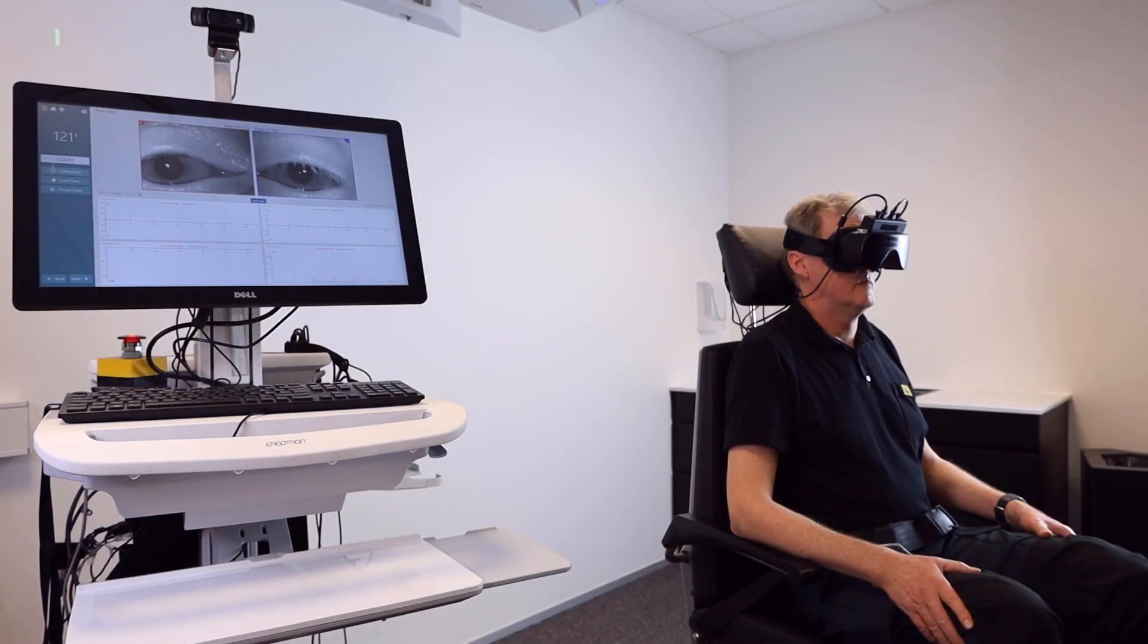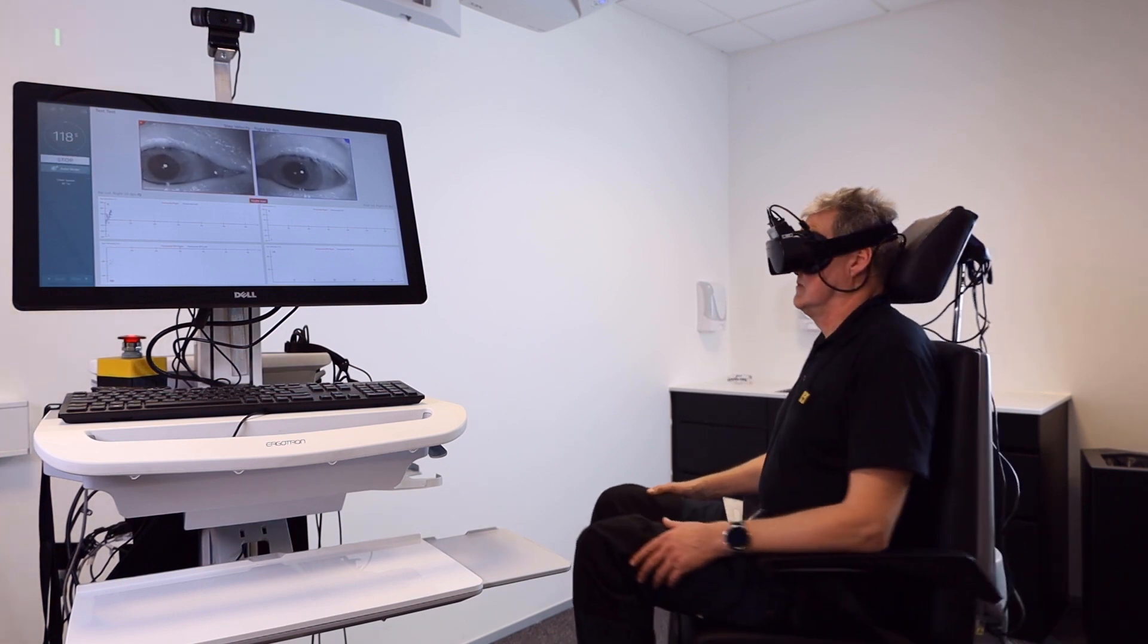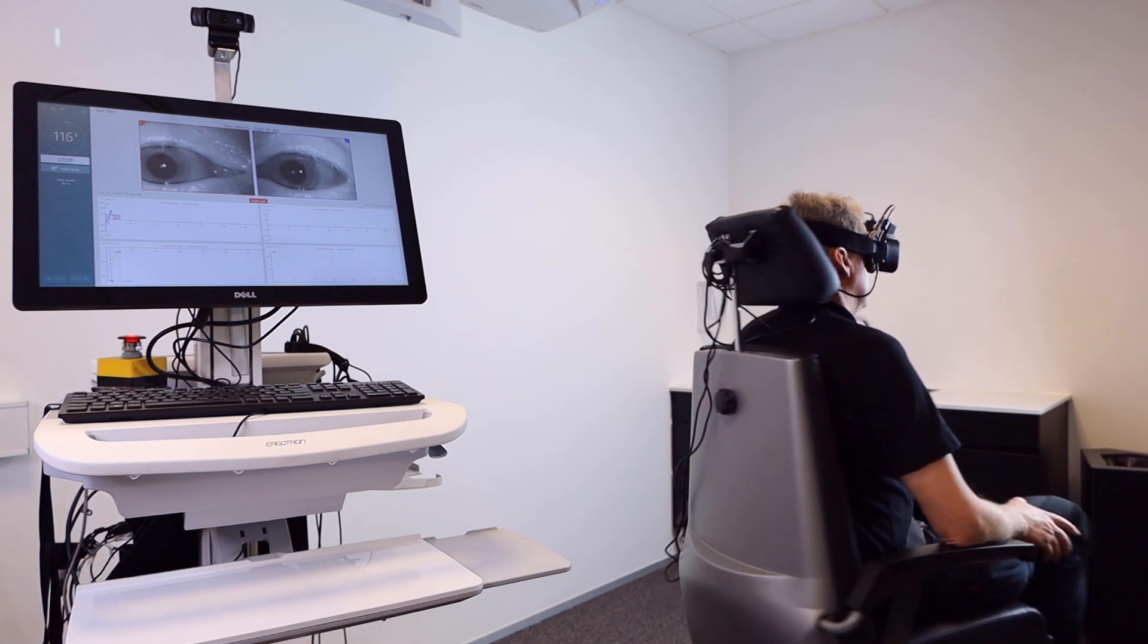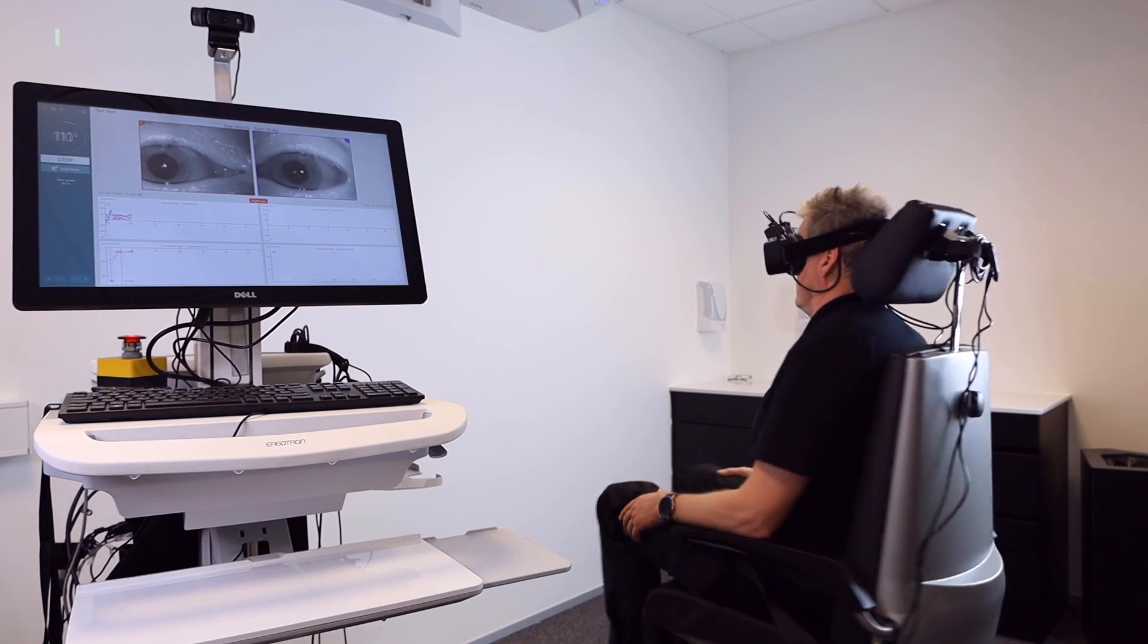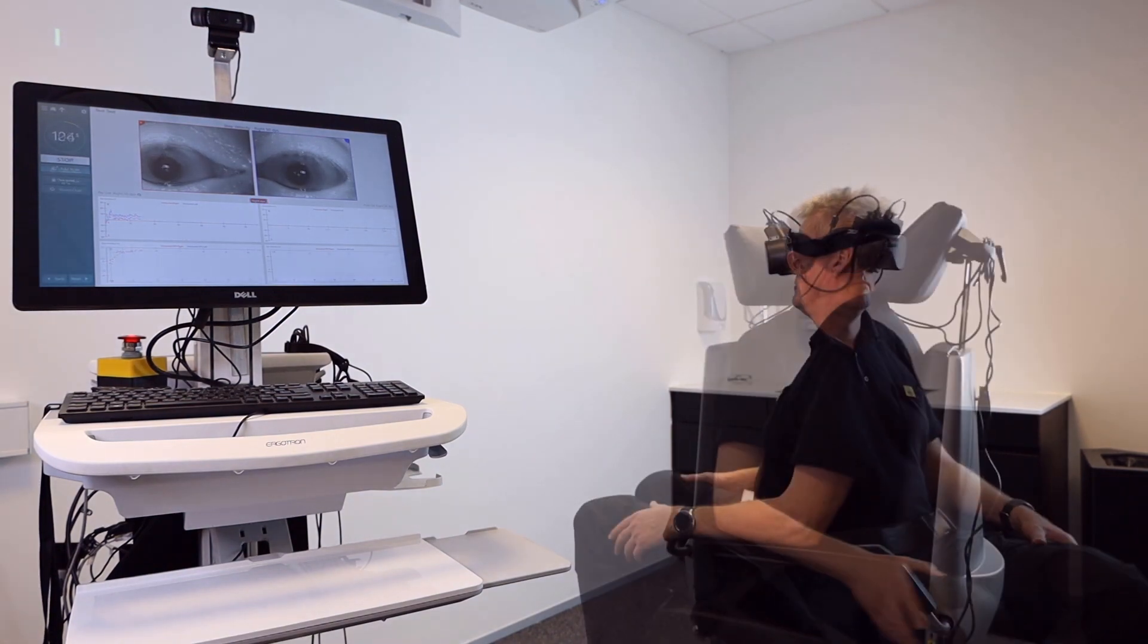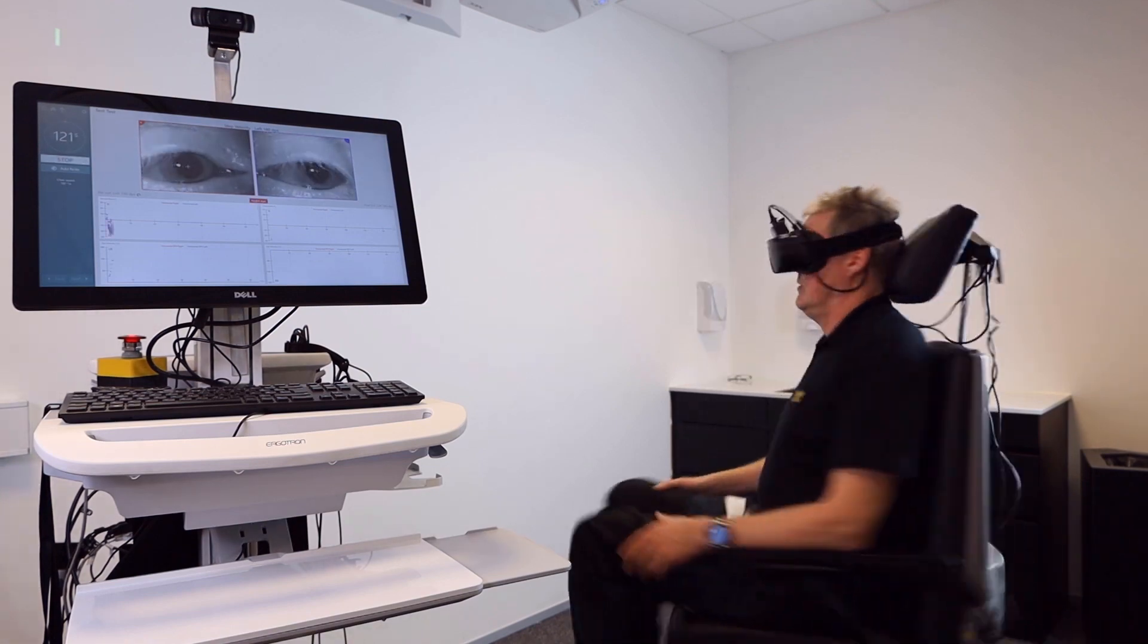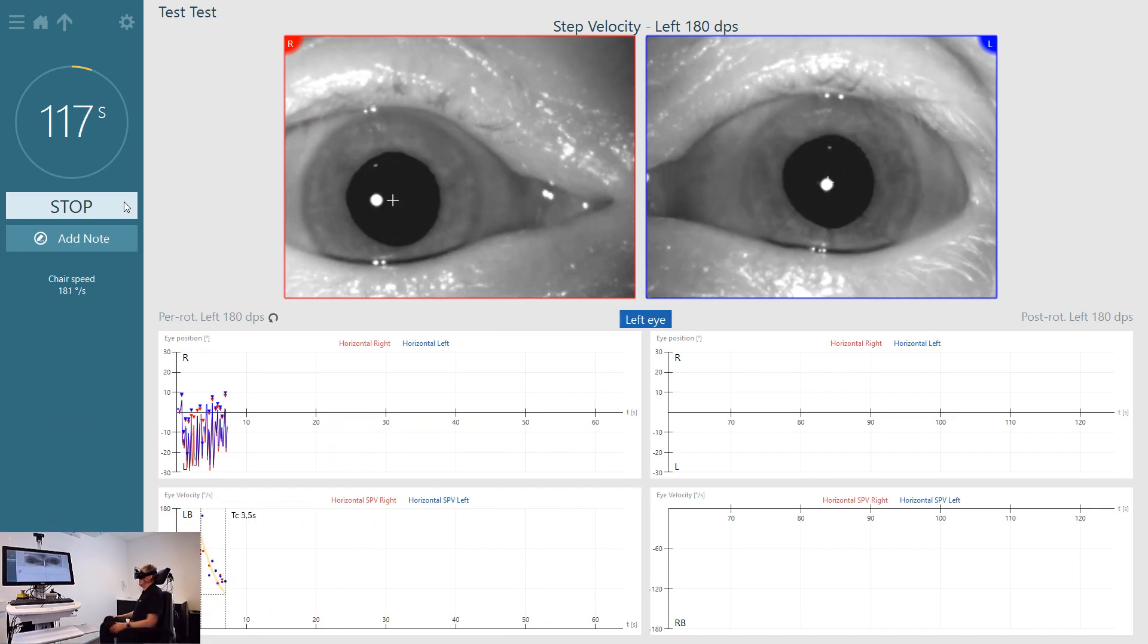The patient is now rotated in the other direction with the same acceleration and deceleration and at the same velocity. This is so that the time constants from both sides can be compared, giving a time constant asymmetry measurement.